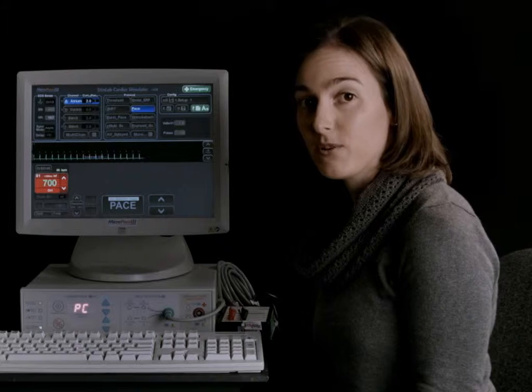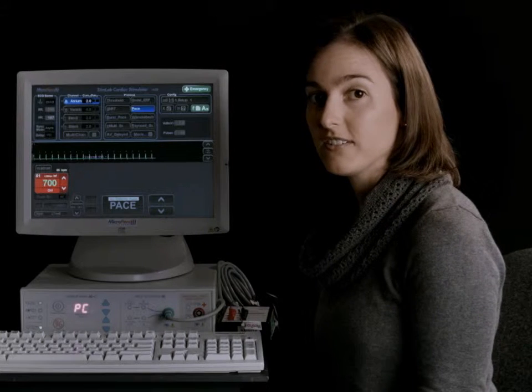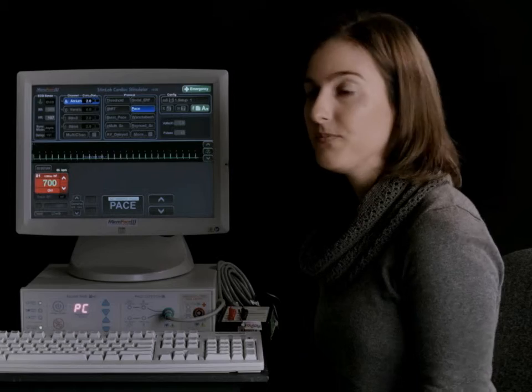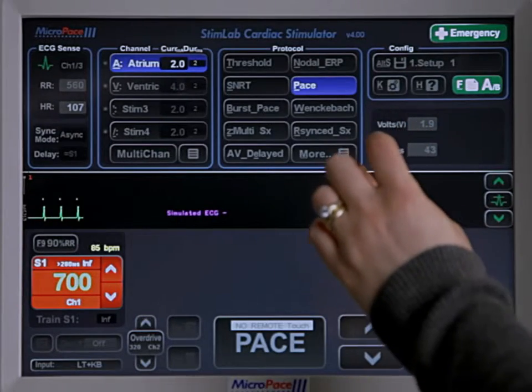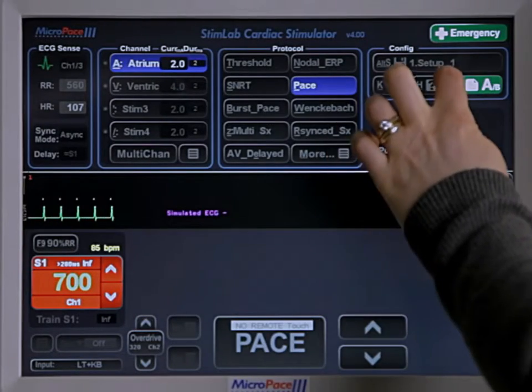Micropace is designed to be used by both expert and novice users. To help with this, there is an extensive help menu. To get to this, you press help on the touch screen.